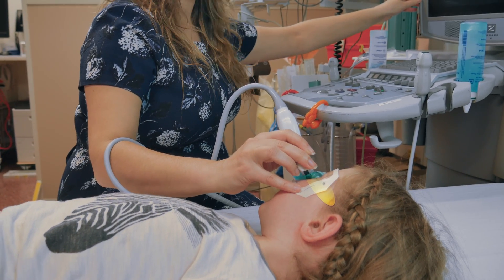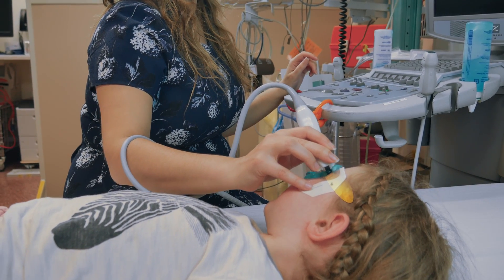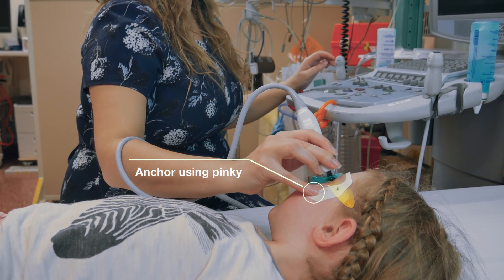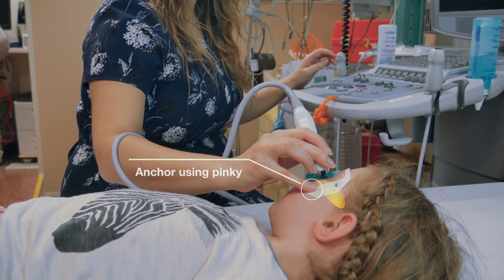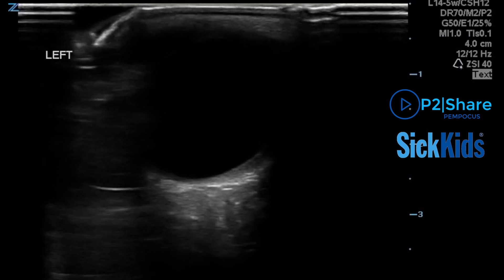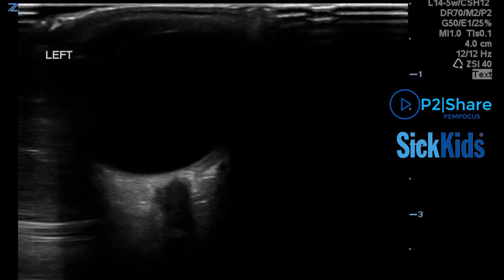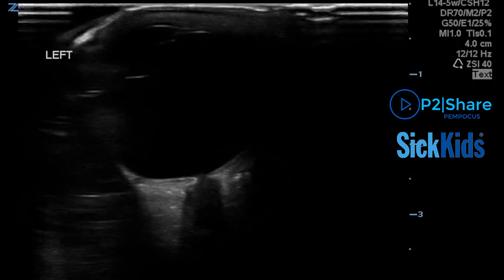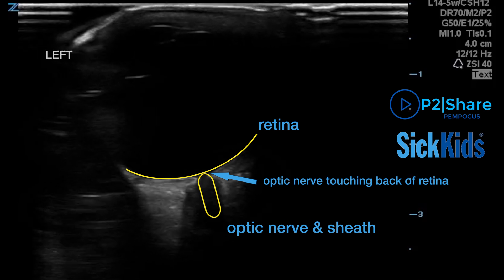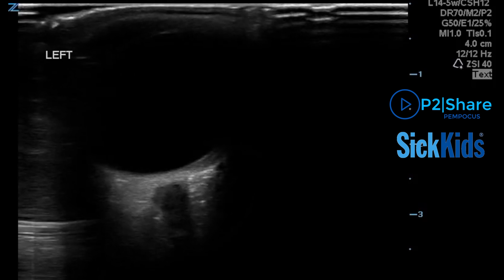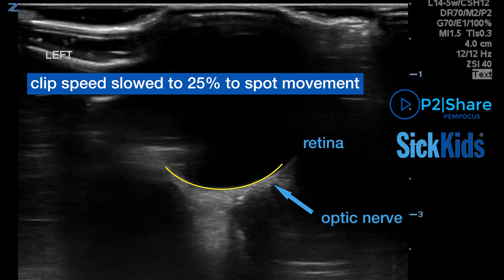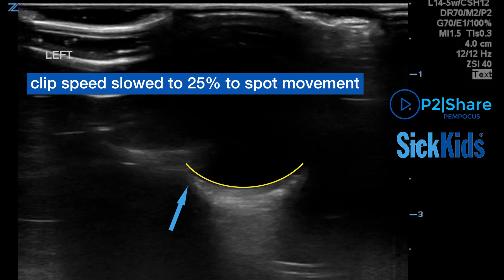In order to obtain the ocular transverse view, the probe is placed horizontally over a single eye. Remember to anchor your hand on the patient to gain optimal control for minute movements and to avoid putting high pressure on the eye. Use larger movements to find the globe, and then use small movements to find the optic nerve and structures of interest. To assess for papilledema, the ideal view is where the optic nerve hits the back of the retina; from that point, scan on either side of the optic nerve using micro movements of sliding and fanning. This view is also optimal to assess lateral and medial extraocular movements.